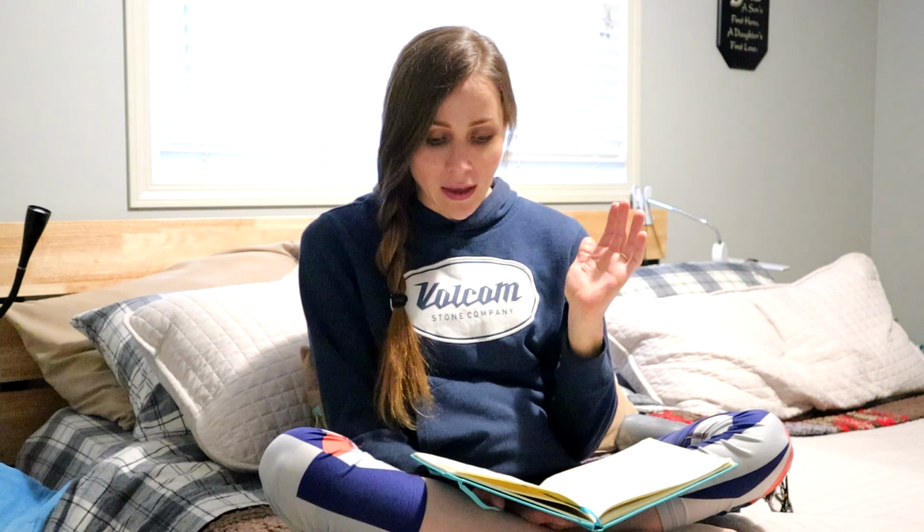It's kind of difficult to learn because, especially if you can't feel, then you have to be able to do it by touch technique, which can be really difficult. And if you have lower hand dexterity or hand function or something like that, then it can be a challenge to do intermittent catheterization because you're having to catheterize multiple times a day, and that can take time and be difficult. And then the last thing is just that it's not possible to be done independently by some people. So there's just some people out there that can't use intermittent catheterization or that couldn't do it independently. So that's a con of it.